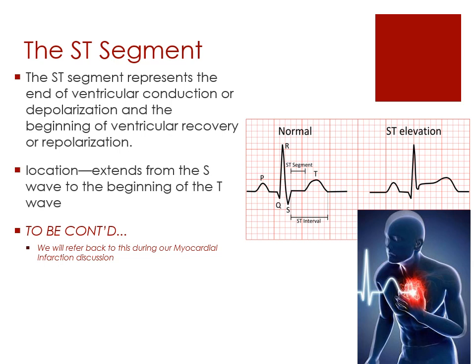So when that happens, the ventricles contract, and then those ventricles will have to relax. But in that little bit of time, we have what's called the ST segment, and that's the end of when the ventricles contract, and when the ventricles are going to start to recover. So there's going to be a baseline. When you hear that they have a baseline on it, that's all that means. Notice in the P to R interval, there's that flat line. That is the baseline. And notice after the QRS complex happens, while we're getting ready for those ventricles to recover and relax, it goes back down to that baseline.